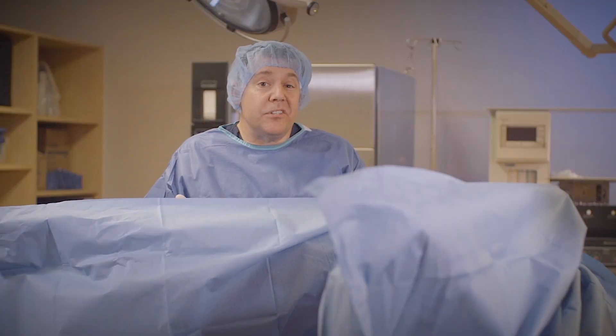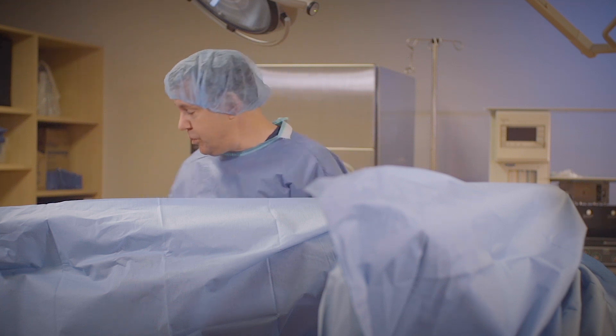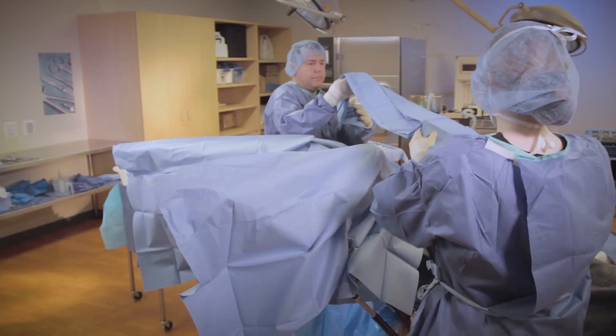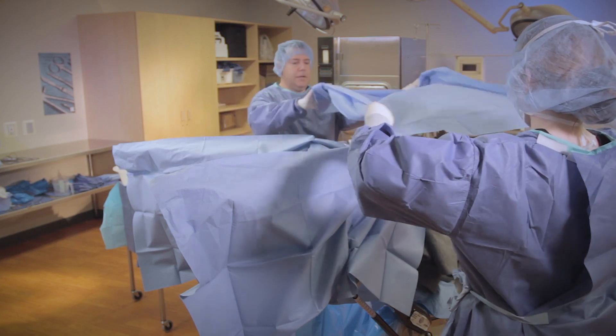Now that the stirrups are completely covered and I've extended the drapes on there, I'm going to go ahead and put a medium sheet on the patient. We're going to make a cuff and drop.